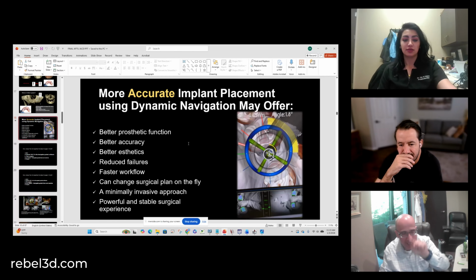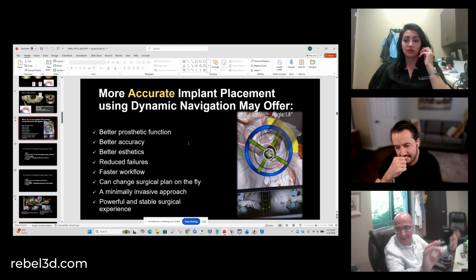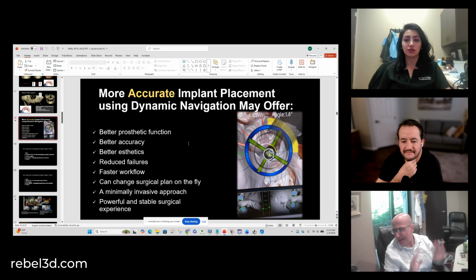So when I do it, I have to make sure that I'm doing it this way. Now I take all this information from her, take her design, put it on my XNAV machine, and start planning based on all the teeth and all the alignment she's giving to me to put my implants exactly where they should go with the angulation and select the MUA, and so on.